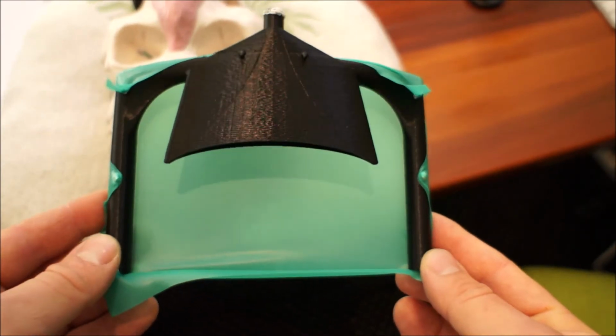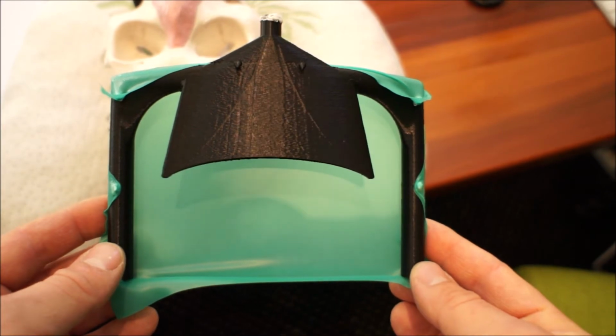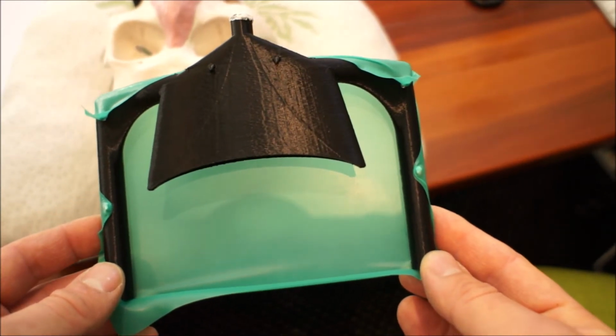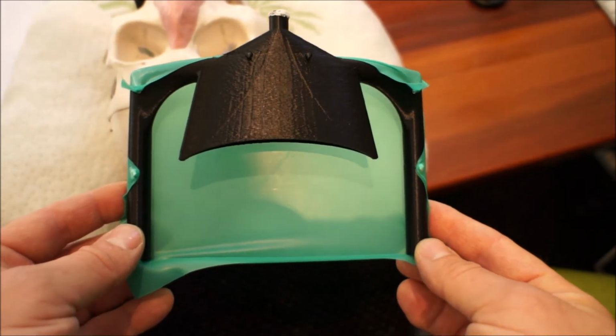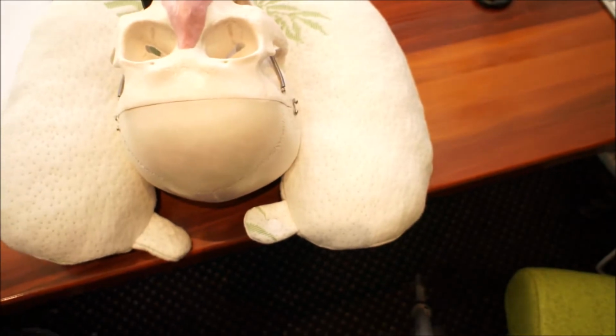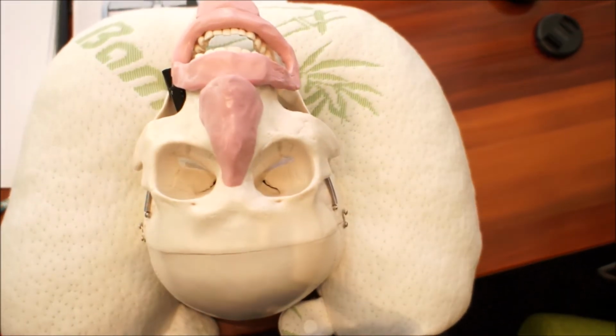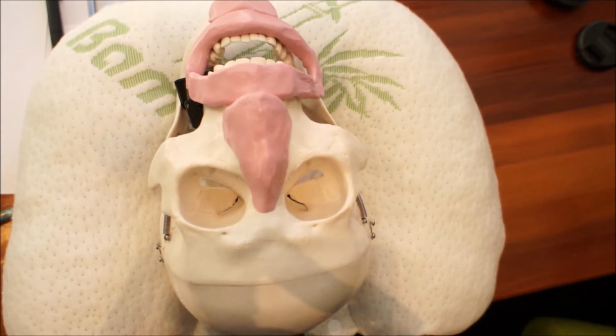But the way I like to do rubber dams, and I realize some people like to do it differently, is to have the upper edge of the dam clear the nostril. So the upper edge of the rubber dam must be inferior to the two nostrils of the patient. They do like that better than having it over the nostril. I mean, we don't want to asphyxiate them either.